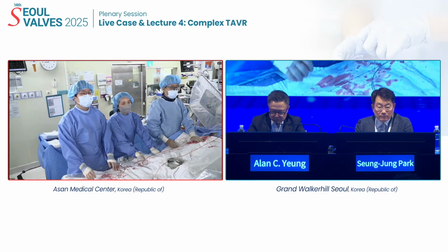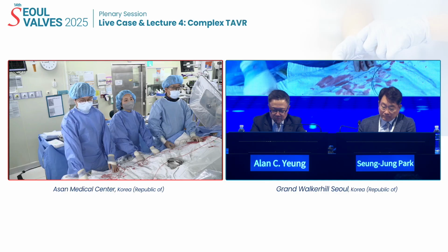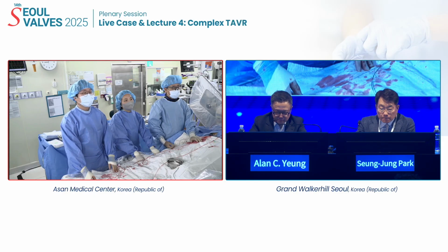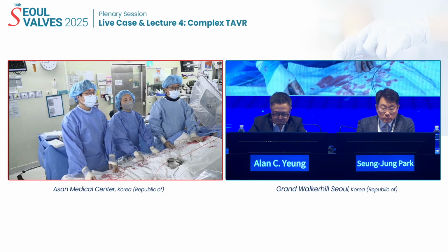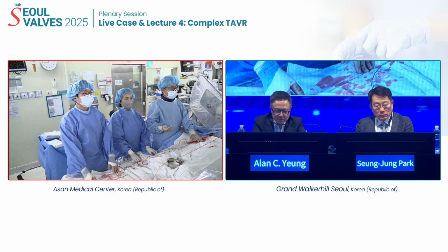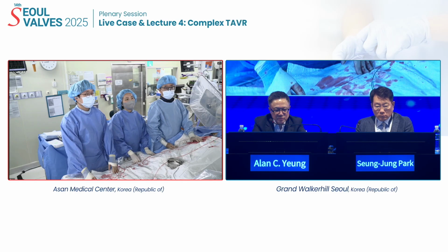Good morning, Alan, and good morning, everyone, and welcome to the second day first live case. This session is a complex TAVR session. We will present diverse complex TAVR scenarios. I'm DW Park. I'm going to introduce our team: Dr. Su-Hyuck Ahn and Dr. Kyung, our third grade fellow.